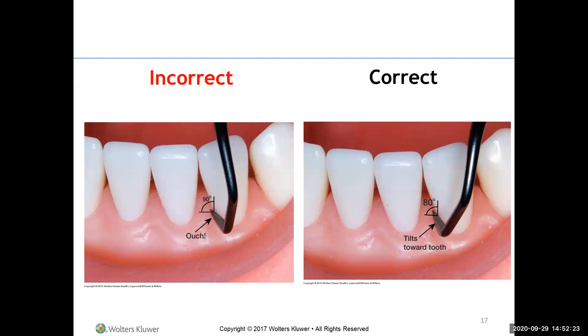On the picture, the terminal shank is perpendicular to the face of the blade — the face is at a 90 degree angle, and you can see where the other blade would hurt the tissue. By tilting the terminal shank slightly towards the tooth, the face of the blade angles toward the tooth just a little bit, resulting in more correct angulation.